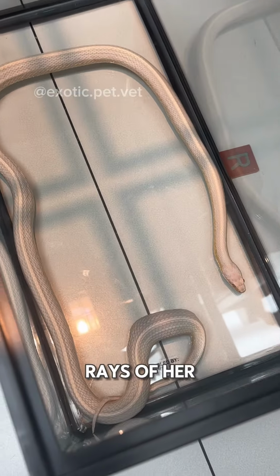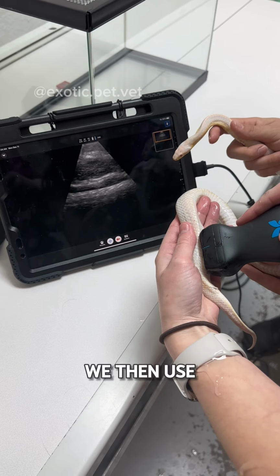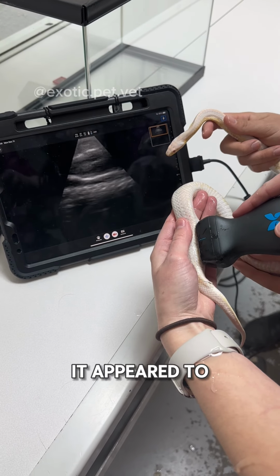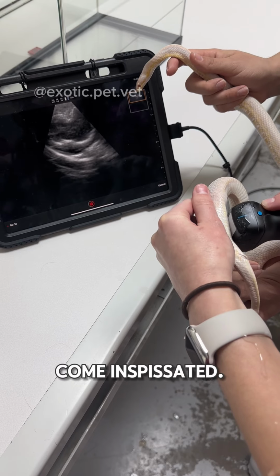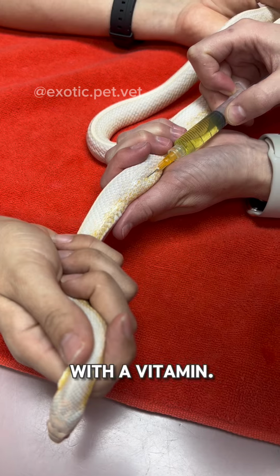Here we are taking x-rays of her to confirm how many eggs were left. Thankfully, it was just one. We then used an ultrasound to assess it further. It appeared to have solidified and become inspissated. She was dehydrated and thin when she came to us, so we got her some fluids with a vitamin.